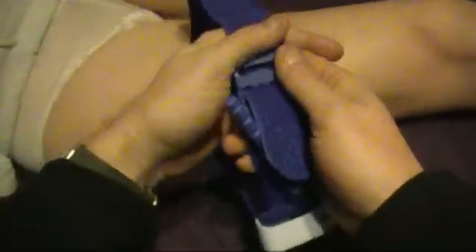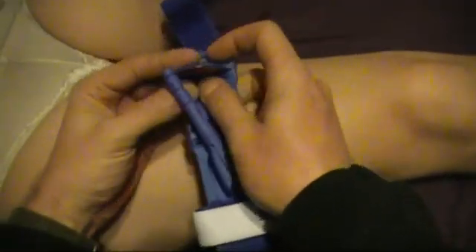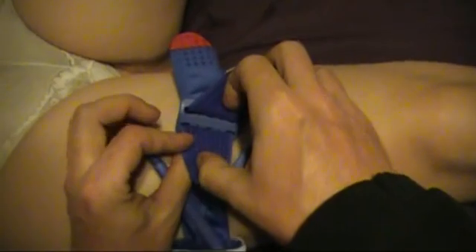Whip out my tourniquet, okay? Now, since I'm kneeling on the patient, I can't slip this around them, can I? So take it and pass it under the leg, okay? And pass it through the first part of the buckle, and cinch it down. Then pass it back through the buckle. You see that, right? That prevents this from slipping. You actually have to put a ton of force on a thigh in order to occlude the bleeding. This is the biggest mistake people make: they half-ass applying a tourniquet.